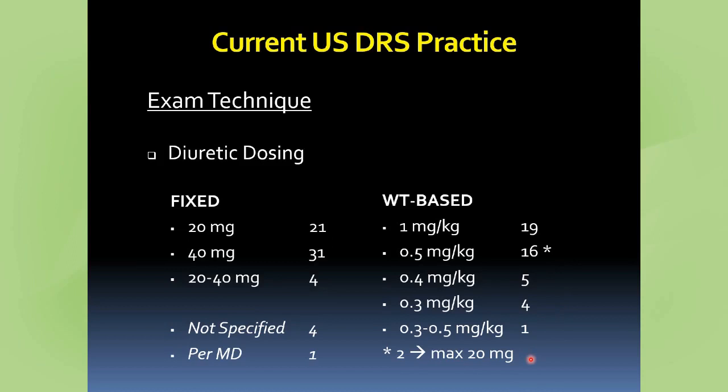So kind of suboptimal. That's not a firm rule though, because the guidelines all do admit that if you have a young patient with good, healthy renal function, you still can get a good diagnostic study, usually with 20 to 30 milligrams. But a lot of our patients don't meet that criterion, so you may want to try to get up to that 40 milligram guideline.